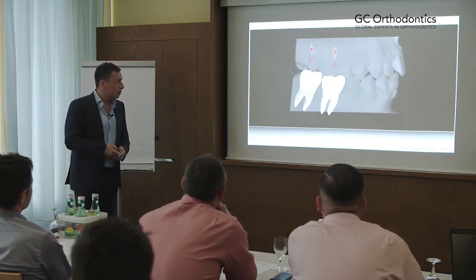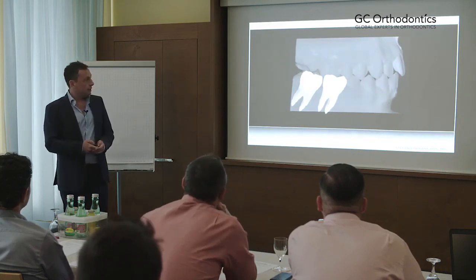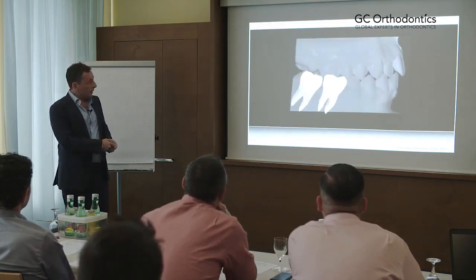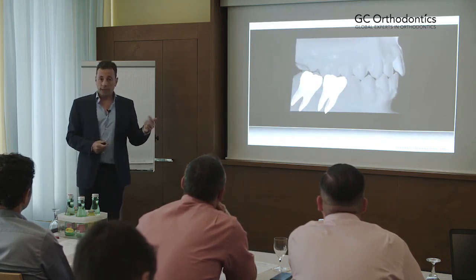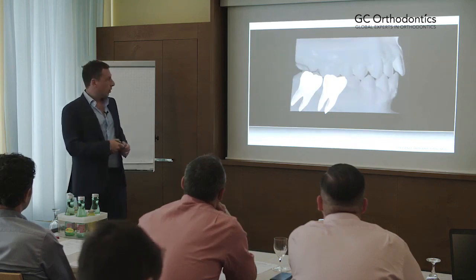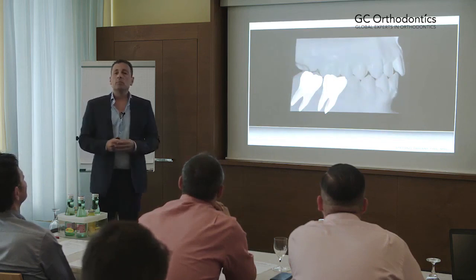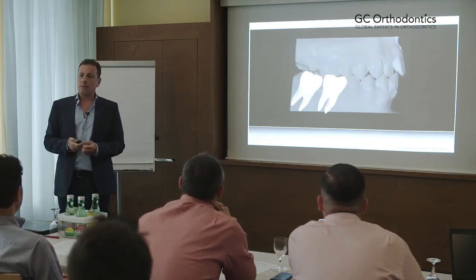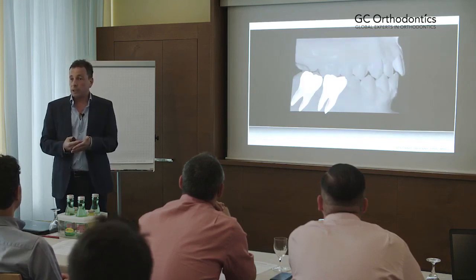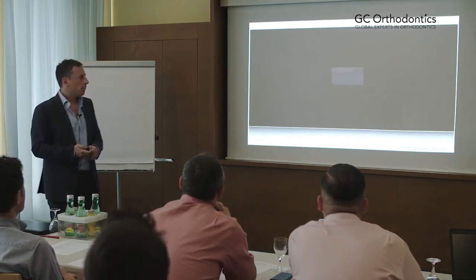But then you will have also 2 moments for which you will tend to get this. And you will have a pre-contact on the distal cusp of the lower second molar. So, in a situation like this, if your patient just gets an arch wire inserted, you will get bite opening. In some cases, this can be beneficial if you've got a patient with a deep bite, but in many cases, you don't want this to happen.